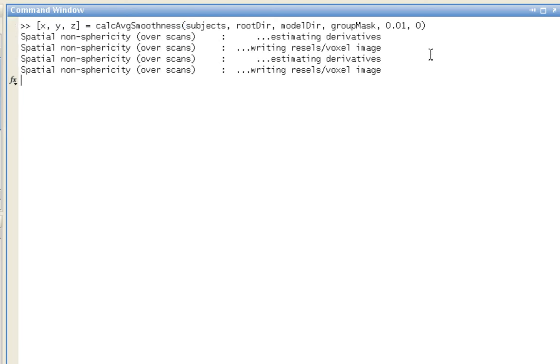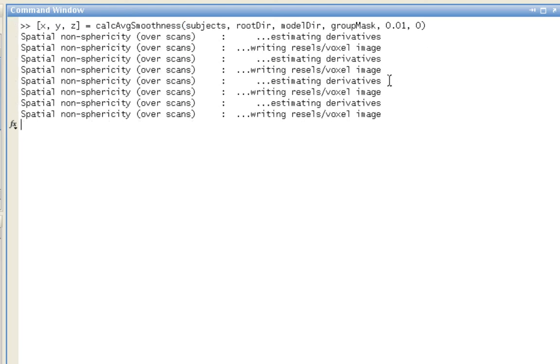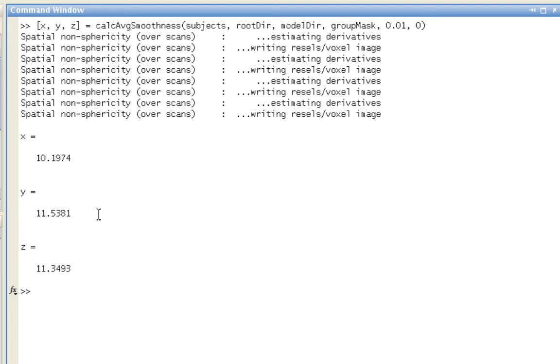There it goes. It estimates the smoothness for each of the subjects, and it averages them, and you get this output of these different values in the x, y, and z directions, which you would then use as an input into 3D CLUSSIM.